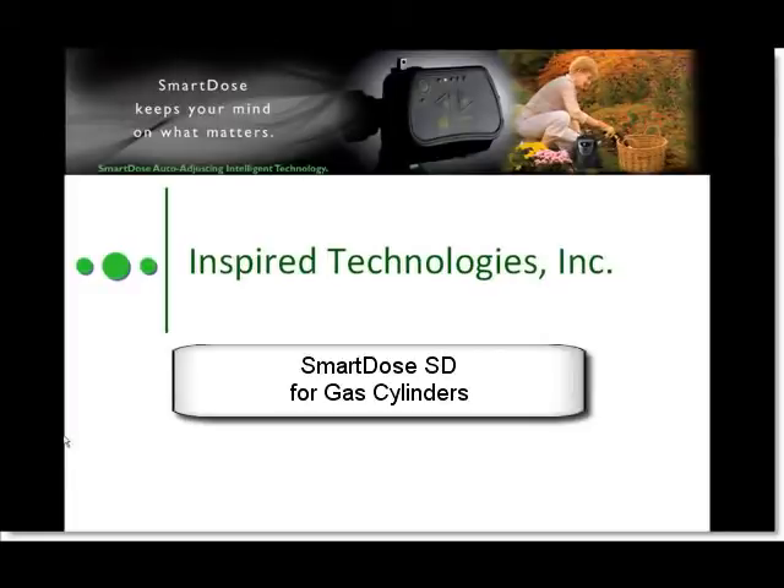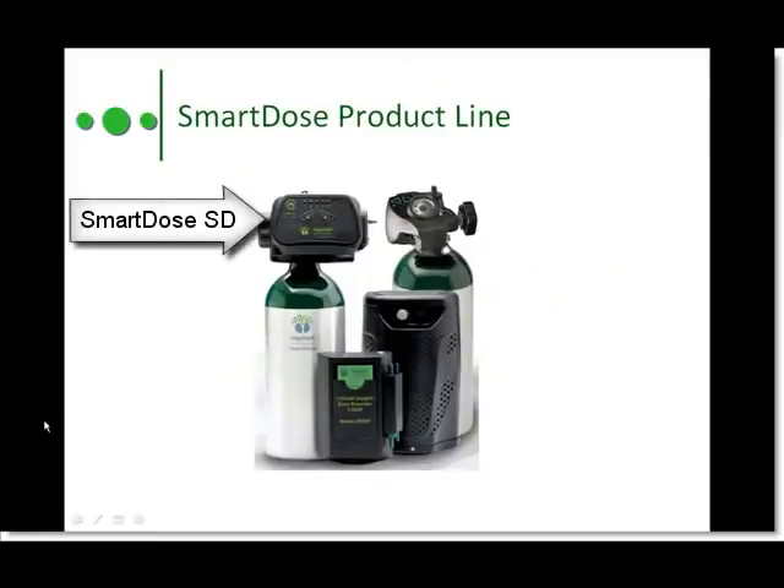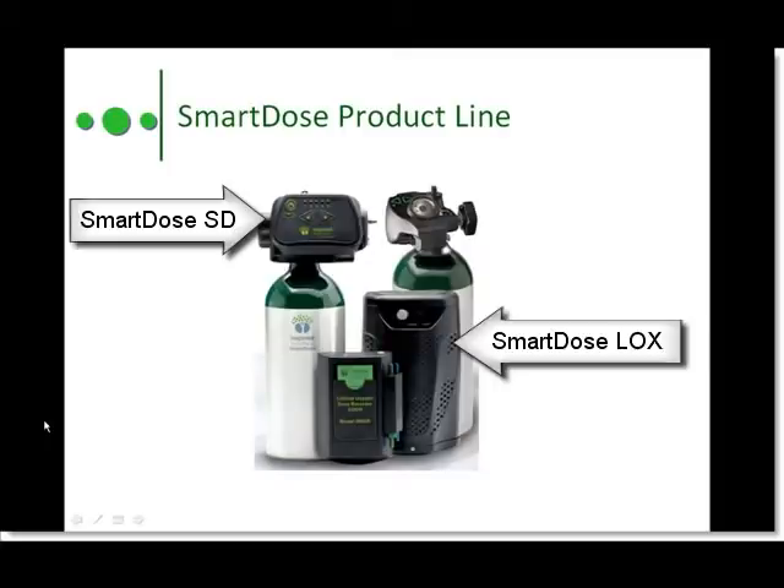Hello and welcome to this quick video overview of the SmartDose SD Oxygen Portable. SmartDose SD fits any standard 870 pin index cylinder, including those sold for cylinder transfilling systems like HomeFill or iFill. SmartDose is also available in liquid oxygen versions and gives the best combination of saturation and duration available.